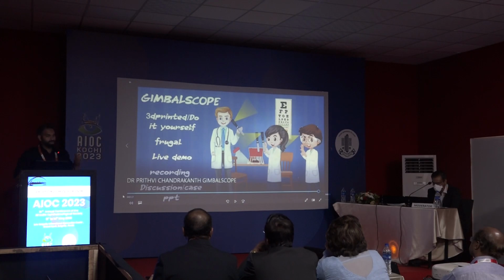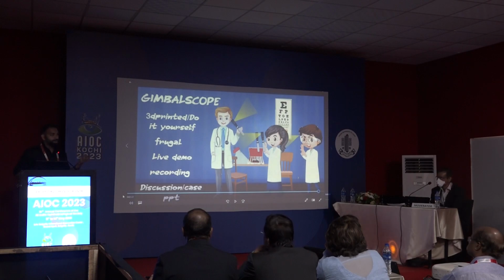You can even connect it to the laptop, and hence it is very simple to teach residents, and you can even make your own library of all these reflexes. Thank you.